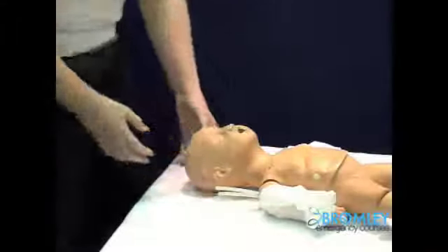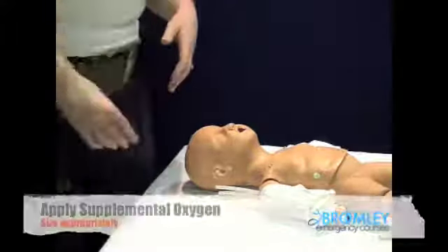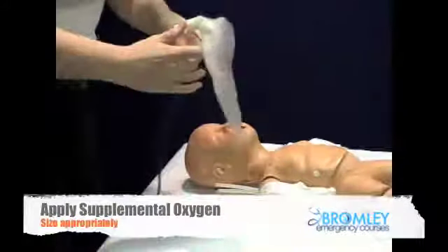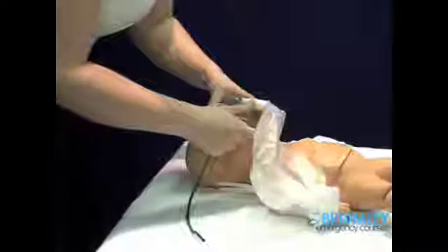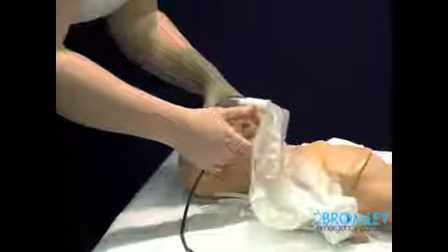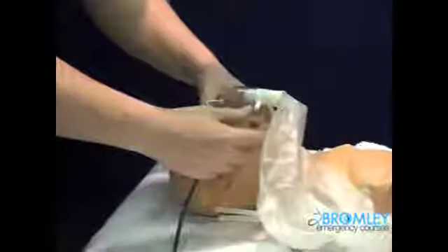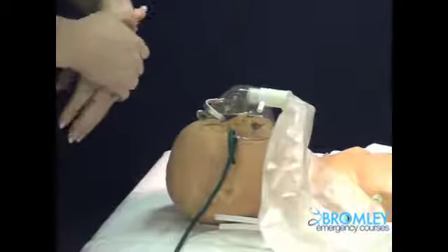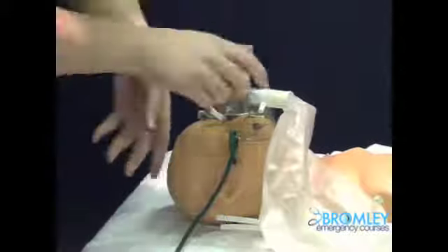So there is respiratory effort, so if we wanted to provide supplemental oxygen, we would just apply a face mask. The face mask should cover the mouth and nose, but not extend beyond the chin. This face mask is possibly a little bit big, so we would look to resize it.